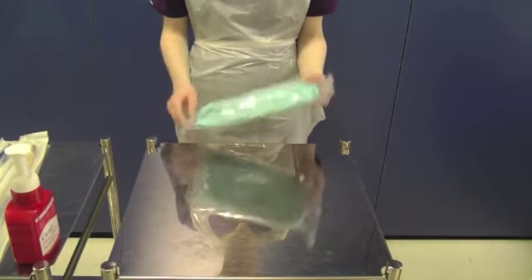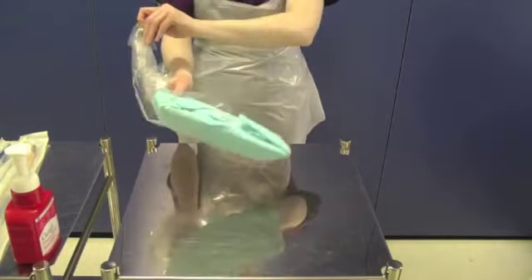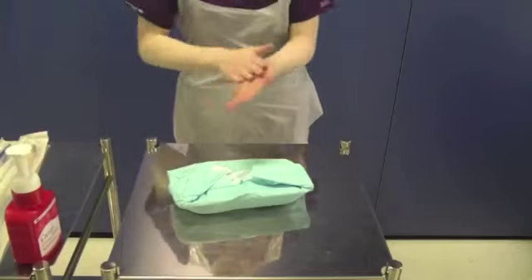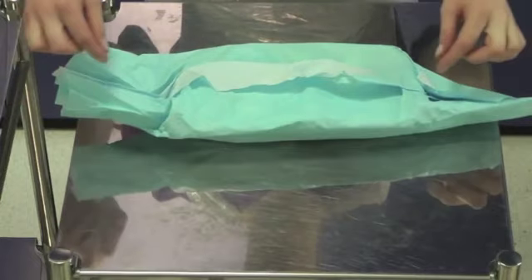Take your catheter pack and check that it is in date. Open the pack onto the trolley without touching the contents. You must decontaminate your hands as you have been touching outer packaging. Carefully open up the sterile catheter pack.